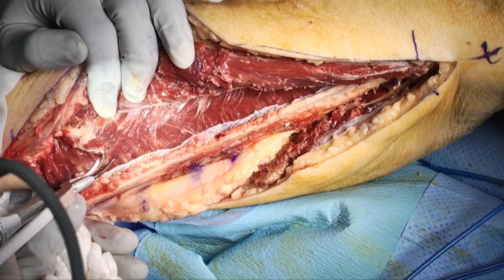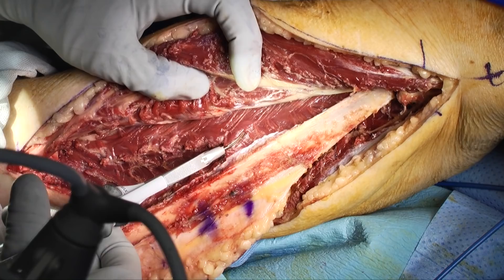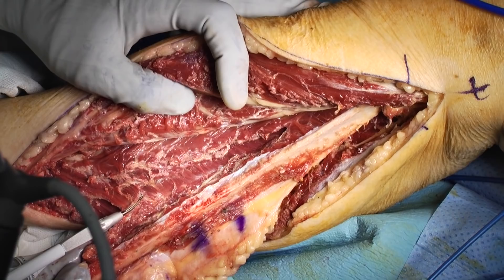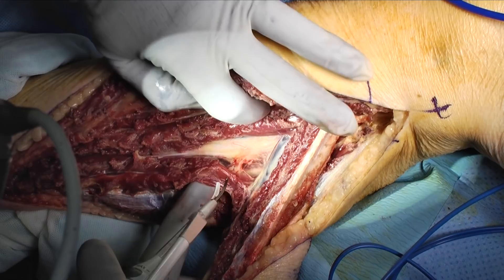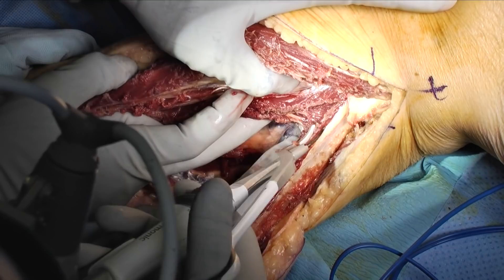To isolate the vessel, divide the posterior tibialis muscle anterior to it and the flexor hallucis longus posterior to it. There are perforators in this muscle, so this needs to be divided in a hemostatic method, using ultrasonic shears. Divide the muscle several millimeters medial to the fibula, as the vessel is up against the fibula at this point and this will prevent inadvertent injury. By dividing the posterior tibialis and the flexor hallucis longus equally, the bone can be further mobilized and lateralized, giving the surgeon more room for dissection. At the termination of the flexor hallucis longus, the peroneal vessels start to diverge medially away from the fibula to join the posterior tibial vessels.